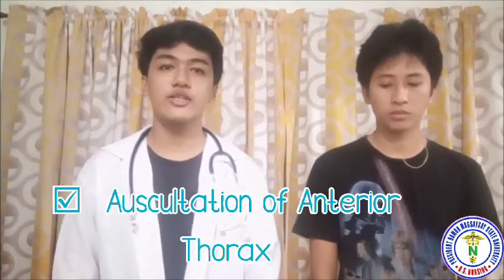Now, let's proceed to the auscultation of the anterior thorax of the patient. Sir, can you please take deep breaths using your mouth as I auscultate your chest?